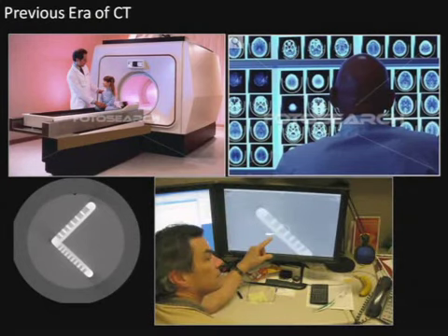But I'll say, even as we fast forward today, even the president of the AAPM, who's 2 offices down from me, you can take one of these, and now they are on the PACS system, but they're still qualitatively designed phantoms. They're not meant to measure a modern parameter associated with image quality, with spatial resolution in this case, which would be the MTF.